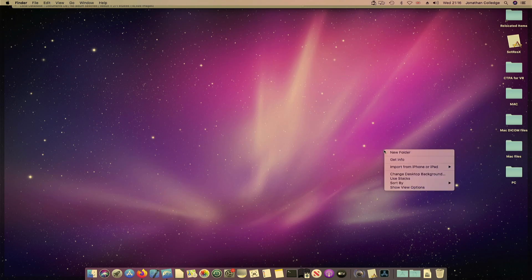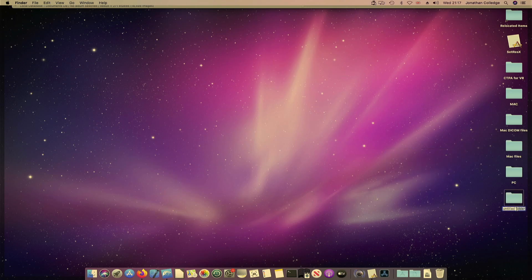So we quickly just create a new folder on the desktop here. We'll name it new just for the purposes of this video. And I've already copied my DICOM files to the desktop. And I like to keep the DICOM files separate to the database. So there's no possibility of database corruption and loss of files. You're keeping the files separate on the desktop.